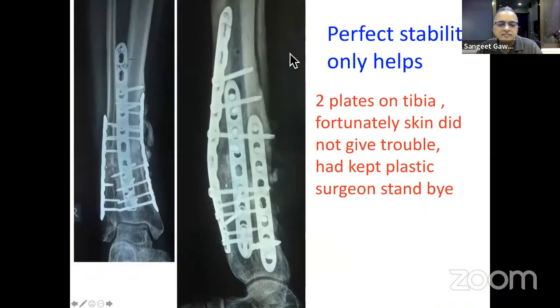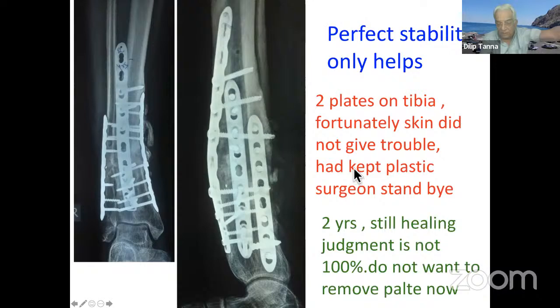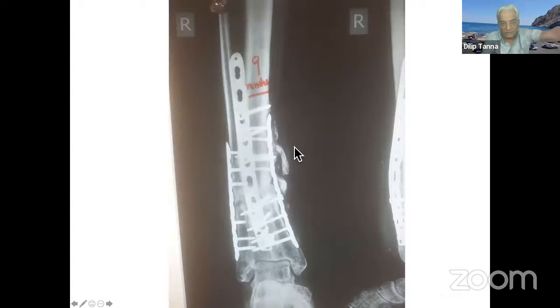Now this gave perfect stability. Two plates on the tibia, fortunately the skin didn't give trouble. And I kept the plastics team on standby for whatever needed to be done. At 2 years it was still healing, the judgment is not 100%. I did not want to remove the plate now, because with all this hardware I wasn't sure whether it had healed or not. The skin was all right, except he felt that underneath the skin he could see some hardware at times. But still, we just carried on. 2 years were there. This is how it was going on.